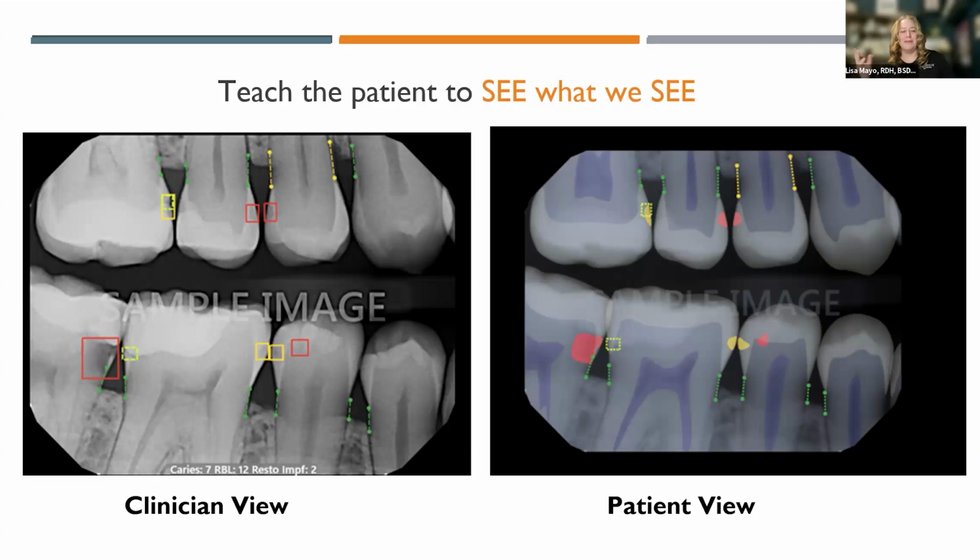I don't know if anybody on this webinar tonight has ever had a patient be really practically honest with them. But as I'm going through these x-rays, I can clearly see radiopacities and lucencies, and to me, those x-rays look like teeth. But when I've asked a patient, do you see what I'm talking about here, and I'm pointing to all these little areas, has anybody's patient ever been so honest to tell you, no, I don't see what you're talking about, because what I'm looking at looks like toes.